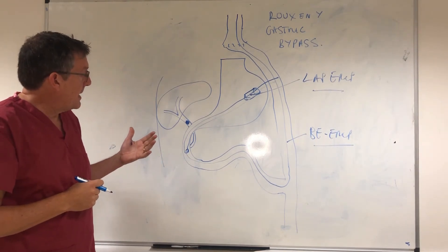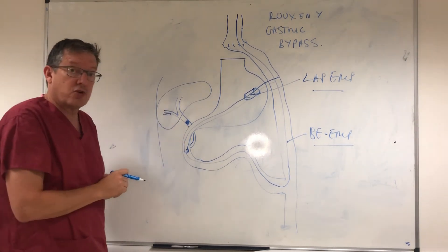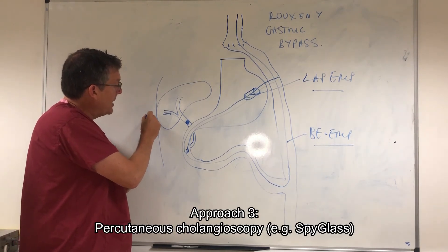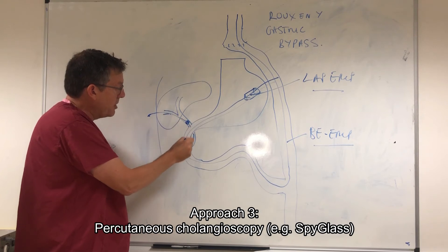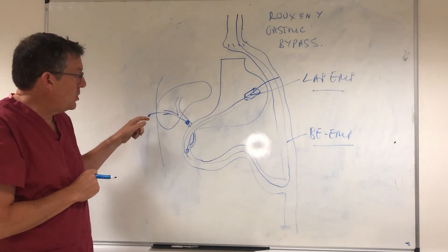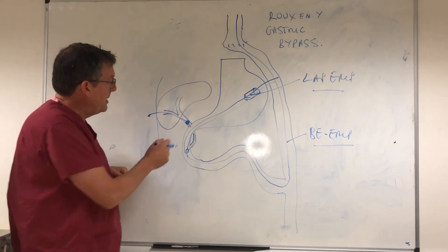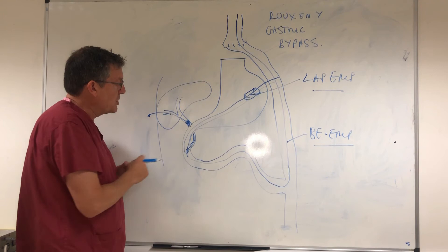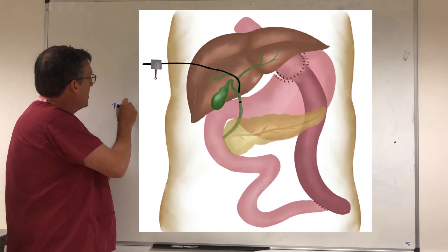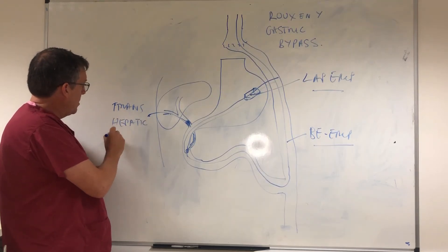The third option is a percutaneous approach. If this patient has biliary obstruction and a dilated biliary tree, one may elect to go for a percutaneous transhepatic approach. We have a video demonstrating this — under direct vision, direct cholangioscopy can be used to fragment the stone and push those fragments through. That is a transhepatic cholangioscopy approach.